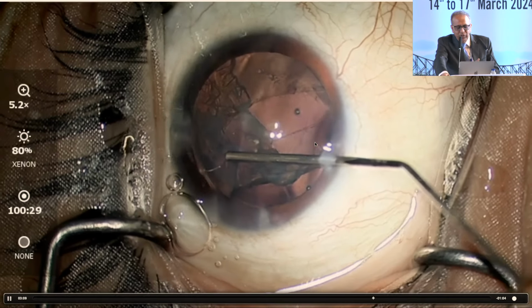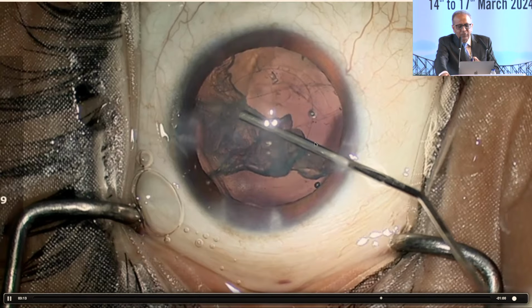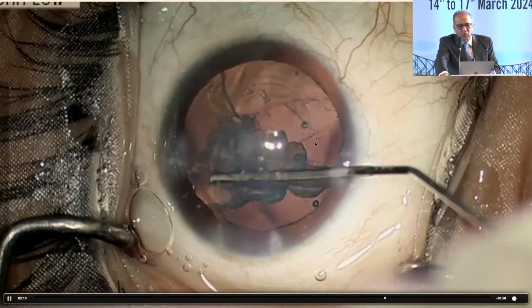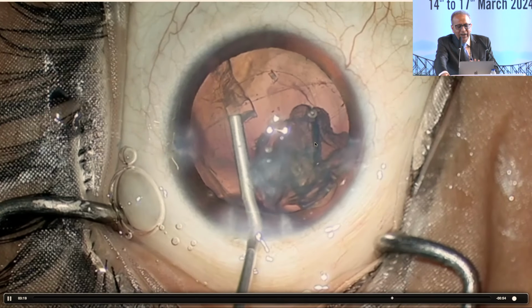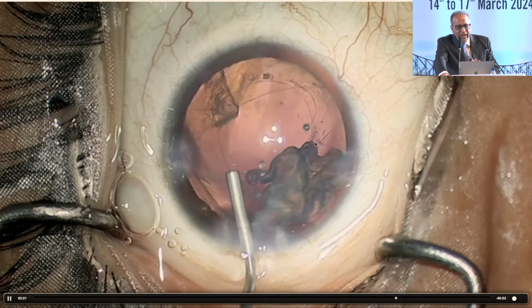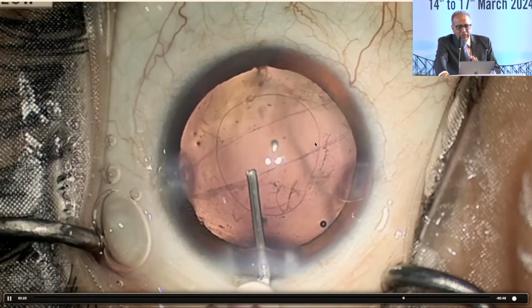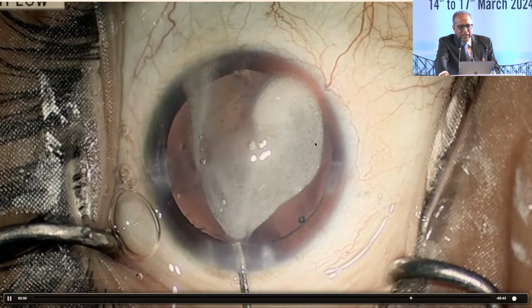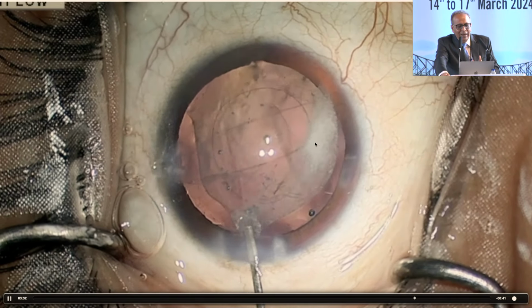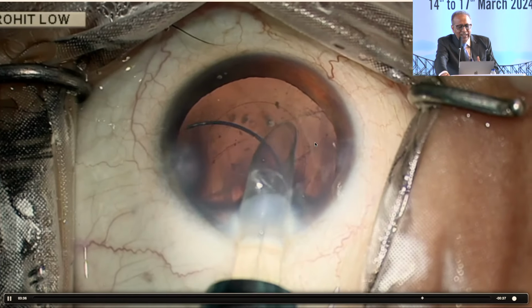You do not have to aspirate, because if you aspirate into the cannula, that will cause chamber collapse. So you just have to strip it and move towards that. You will find that the whole mass has collected, and now I am just viscoexpressing the cortex out. The Kenacort is being used, which shows the absence of vitreous, and the anterior hyaloid phase is intact.